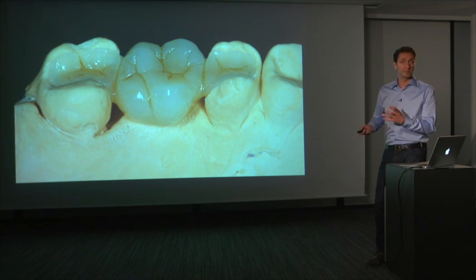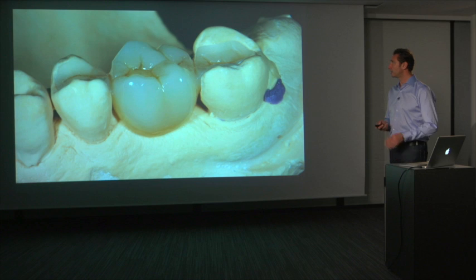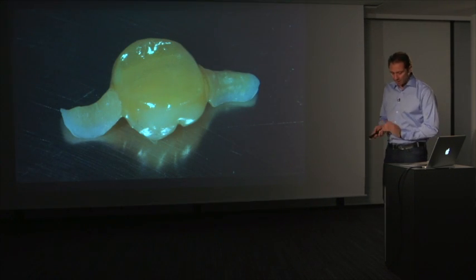Honestly, for me, it's like the best of both worlds, especially in compromised patients, and you can really be as less invasive as possible in this case. You will see how it will behave and how it will end up in the mouth.